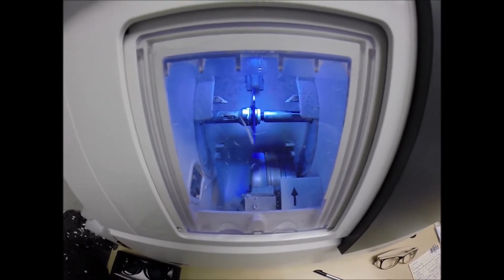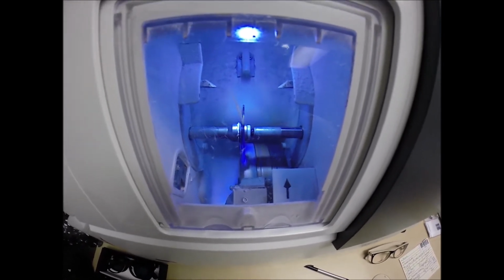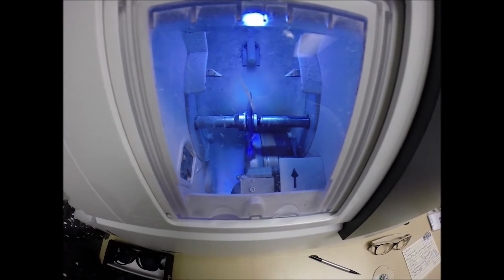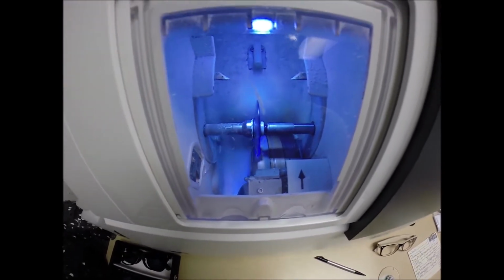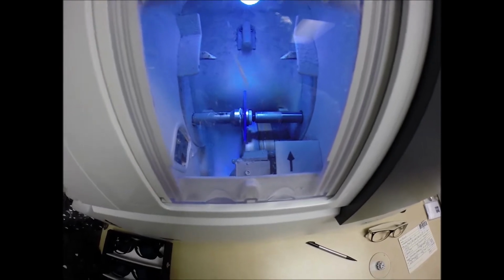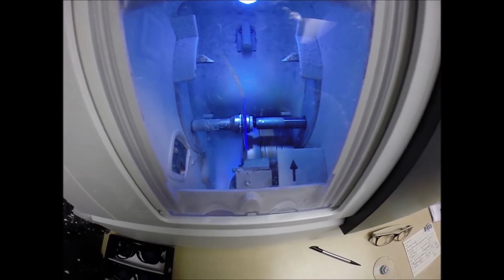It's measuring the thickness of the lens at every point to know exactly where to place the bevel so you have the least amount of edge thickness showing. Now the water in the background is there to catch the optical sawdust. Polycarbonate lenses cut dry, meaning that no water sprays onto the lens while they are cutting. Unlike plastic, high-index plastic, and Trivex, which are different materials that do have water spraying onto the lens for the duration of the cutting cycle. Now water will spray onto your lenses, Brandi, but only for the last 20 seconds to wash away any optical debris that you see beginning to form.